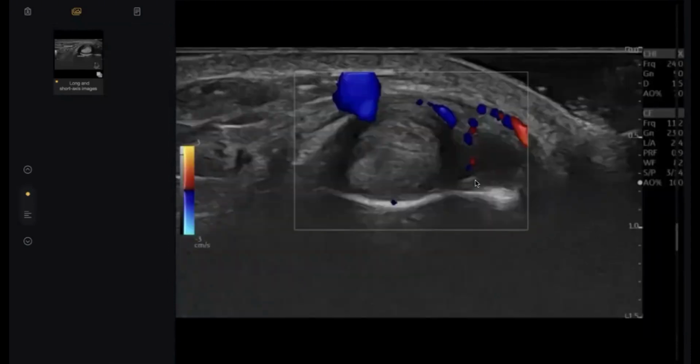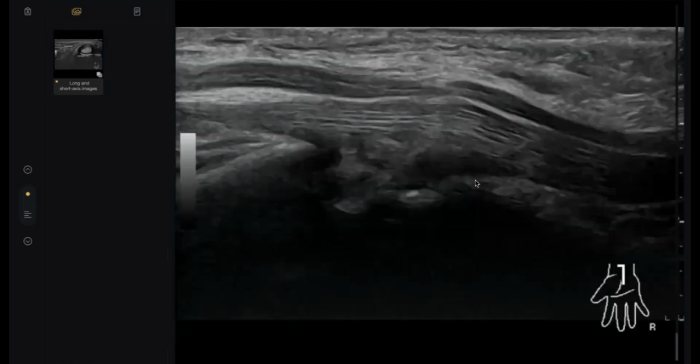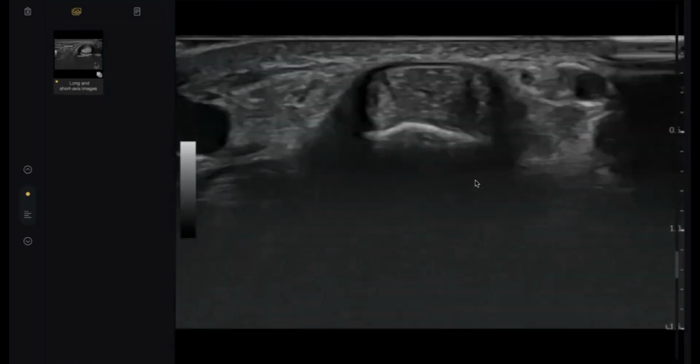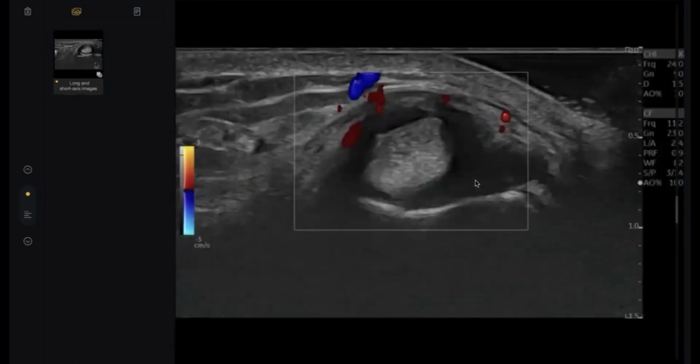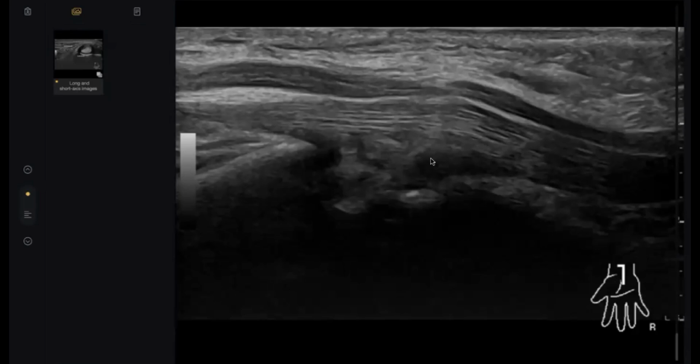Tenosynovitis, when involving the tendon, is also showing changes. So I think it is tenosynovitis or synovitis? I think it's tenosynovitis. Brilliant. Look here, my colleague. It is better to assess the muscle and the tendon longitudinally. By the way, my colleague, this is a very good example of the normal fibrillar pattern of the tendon.